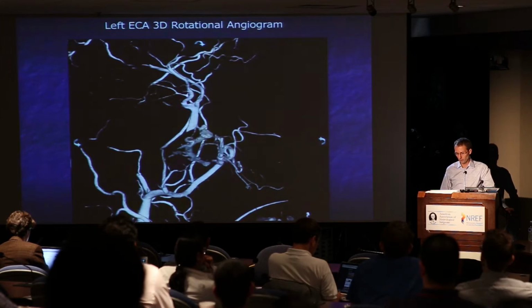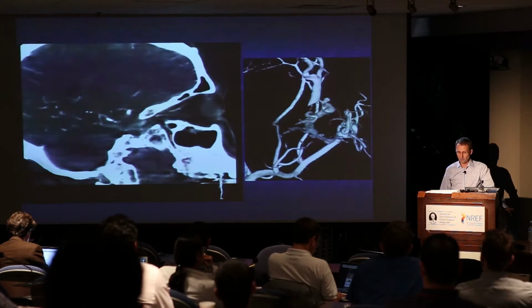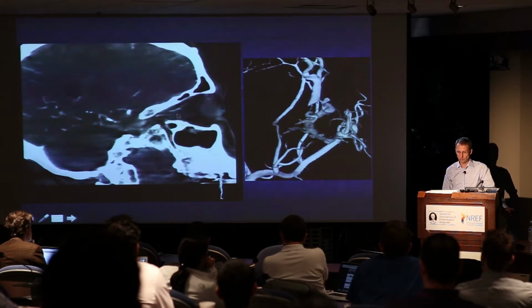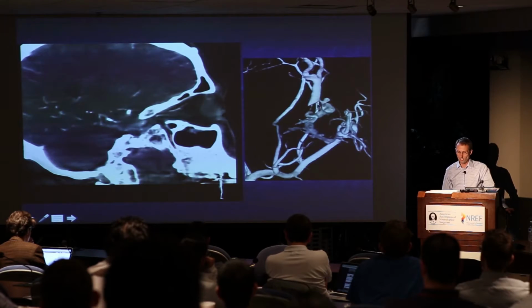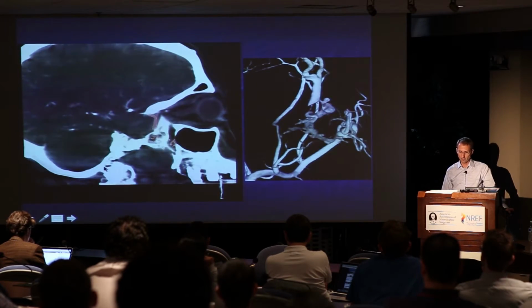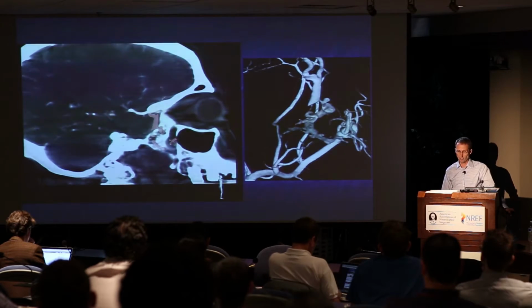What I find useful then is to overlay that with a flat panel CT, and that's what's shown here in a sagittal reconstruction. Here's what we're looking for. I want to know exactly where this is located, and this is overlaid where the 3D is projected in pink.